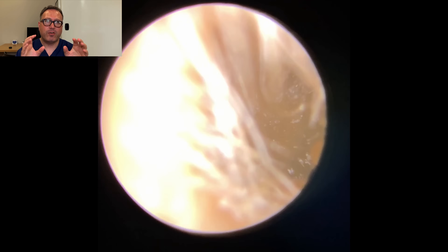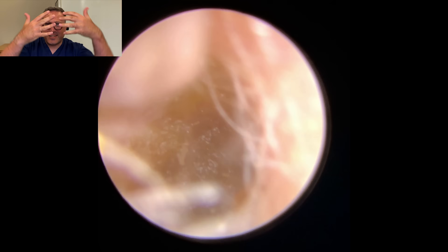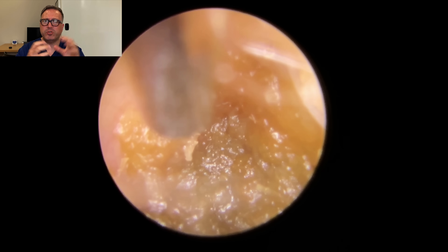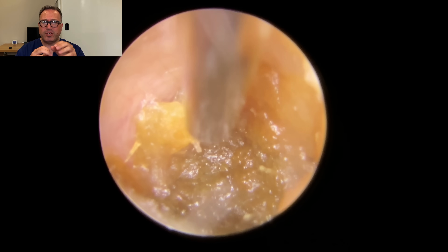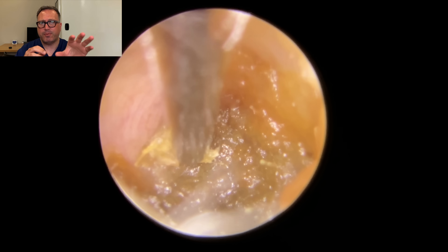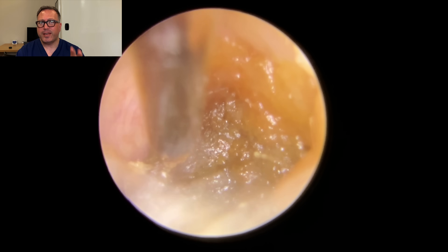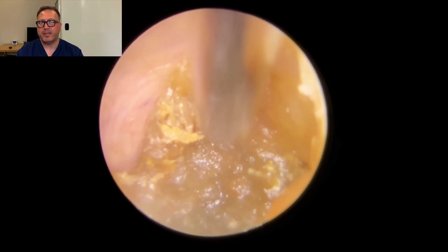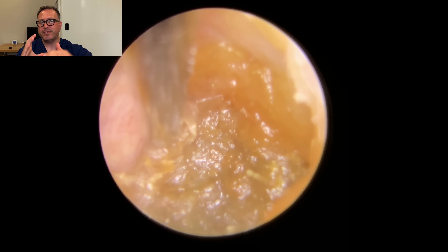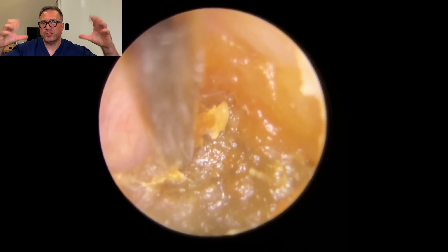So I'm going to put my glasses on — I keep forgetting to do it. As you can see here, we've got a very, very narrow entrance to the canal. Lots of these little tiny hairs all around the outside edge — very fine hairs which protect the ear canal from getting large amounts of dirt or debris down inside it. We've just got through that and you can see a very, very deep piece of hardened-up wax.